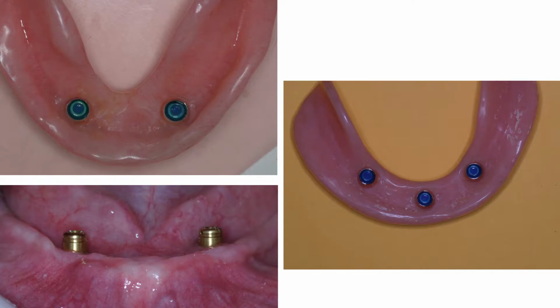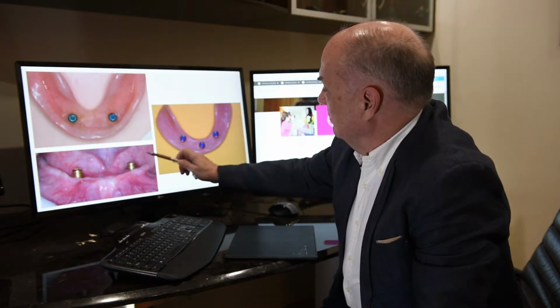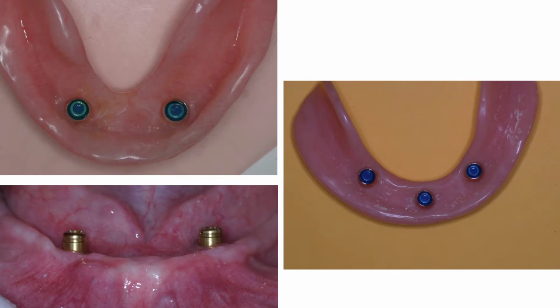But there are other options. And there are other options that we've tried over the years: a 2-implant overdenture with 2 press studs, or a 3-implant overdenture. Now, they've got a high satisfaction rate on the fixed bridge, but there's also a fairly high satisfaction just on a complete denture with 2 or 3 implants.